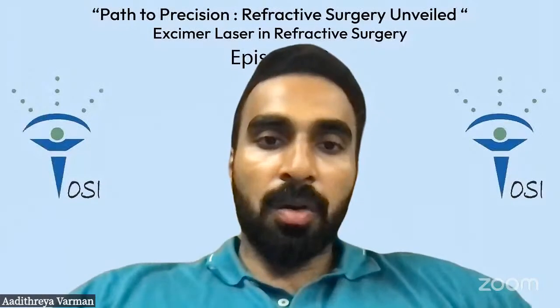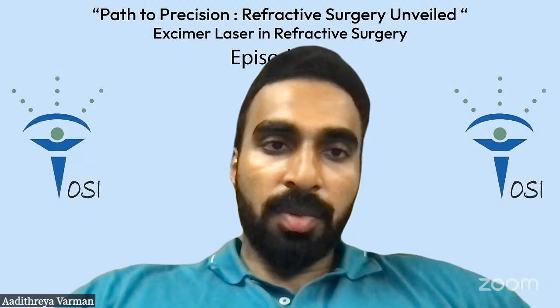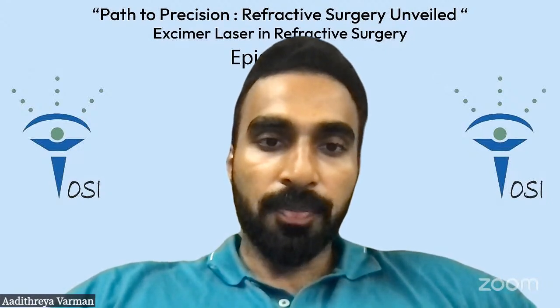So by nature, all of my smile caps are at a deeper level. They are at 140. So if they come later to me for Presbyopic, I do a 90 micron flap over it and just proceed as usual.